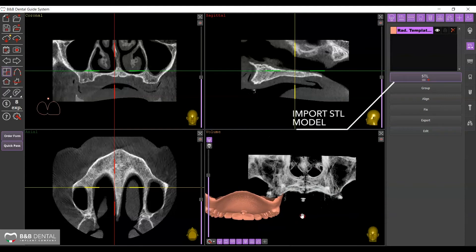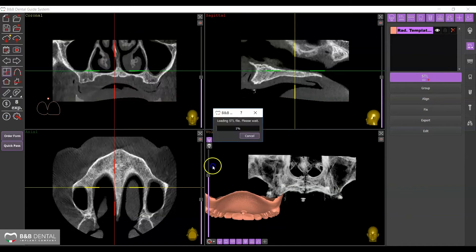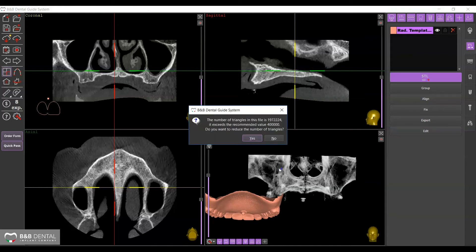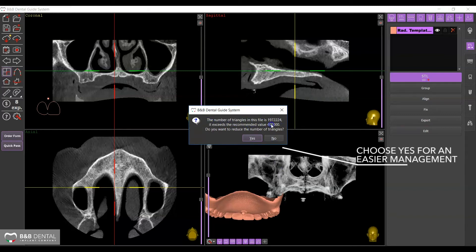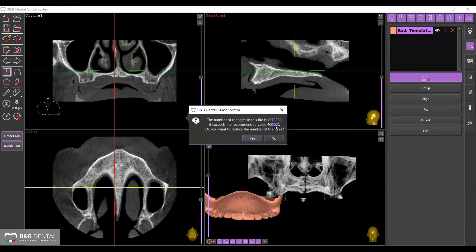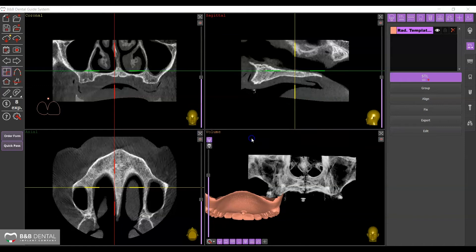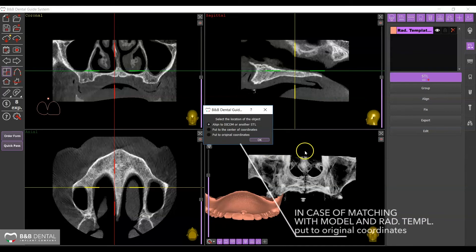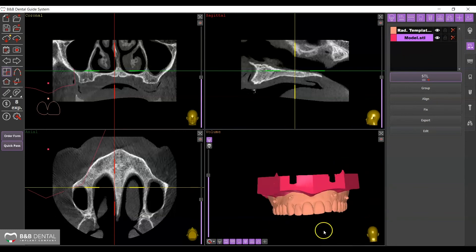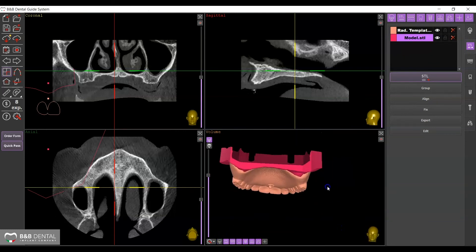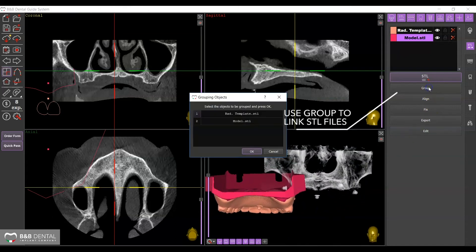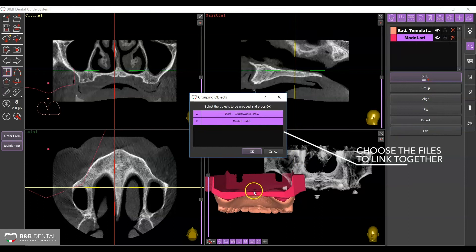Select Add STL again and import the file corresponding to the patient's model. Two STL files must be imported: one containing the model and the other corresponding to the radiological template. A window will appear asking you to decrease the model mesh in cases where models have extremely complex meshes — click Yes for a faster import. Align the new STL by selecting Put to Original Coordinates and proceed. The two files are now both precisely mutually positioned. Group them together using the Group function by selecting the two files — Model and Radiological Template — in the window that appears and pressing Confirm.